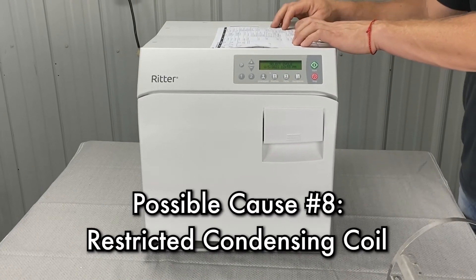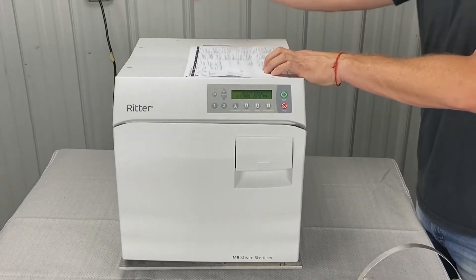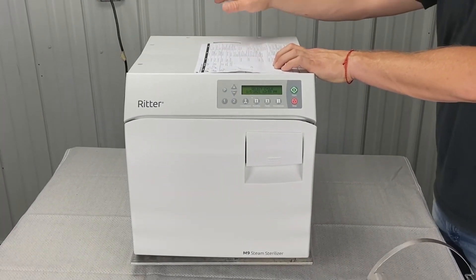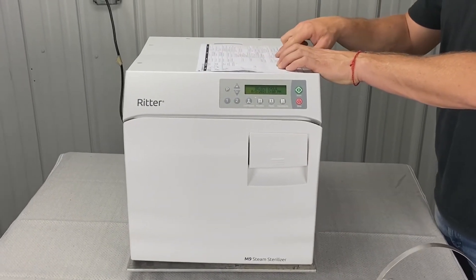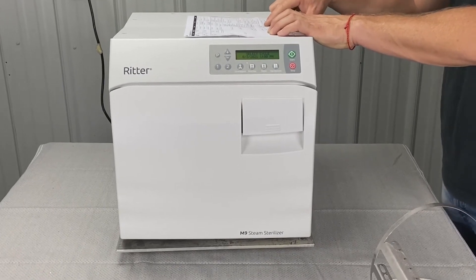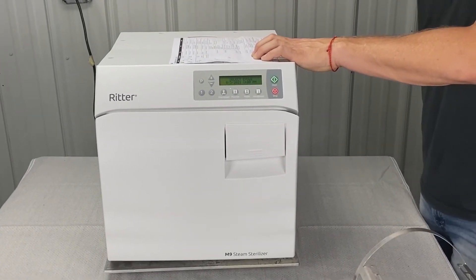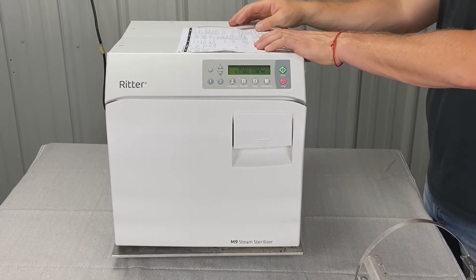A restricted condensing coil is another possibility. The condensing coil is inside the reservoir. You have to take the back panel and top cover off to access it. We'll have a video for that, but you can also just give us a call or send it in for repair. Check for blockage in the coil and make sure the weep hole is present and not obstructed — there's a weep hole underneath the bottom of the coil.